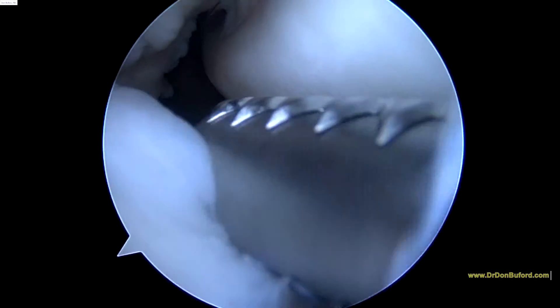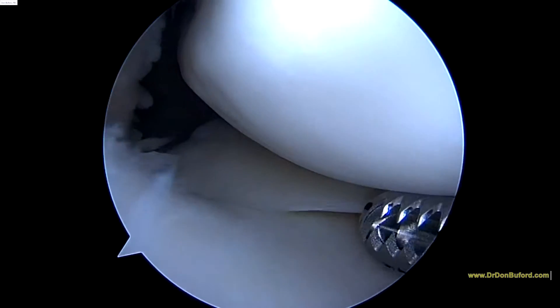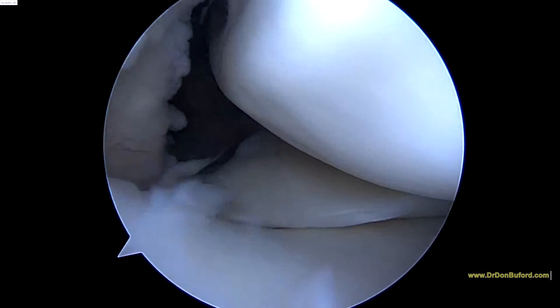That instrument you see spinning around is a shaver, and this is kind of our workhorse instrument in arthroscopy. It allows us to debride any rough edges, and you can also use it as a probe. But that meniscus there looks pretty good.